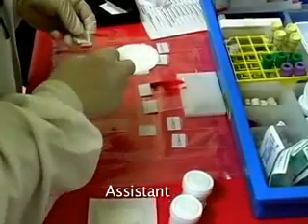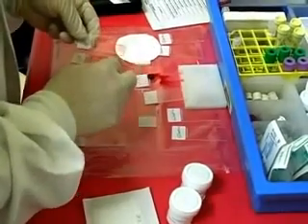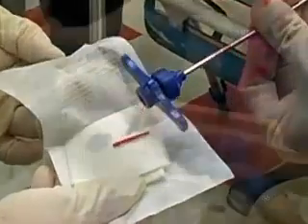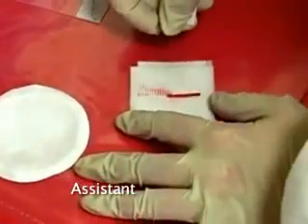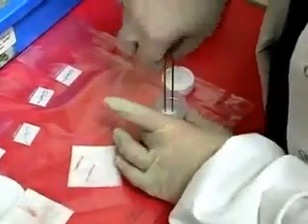A technician is often available to assist with preparation of the bone marrow aspirate and bone marrow biopsy. Aspirate smears may be prepared at the bedside from unheparinized bone marrow aspirate; this should be done quickly to avoid clotting of the specimen. Bone marrow aspirate may also be sent to the lab for further analysis in heparinized syringes. The core biopsy specimen should be collected onto sterile gauze or a slide and inspected for adequacy of marrow. A touch prep of the biopsy core can be made, allowing for morphologic analysis similar to that obtained with an aspirate.